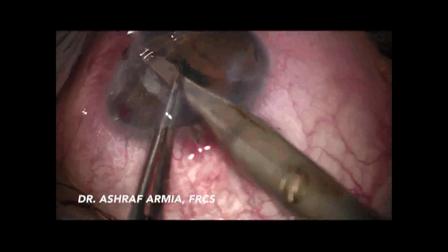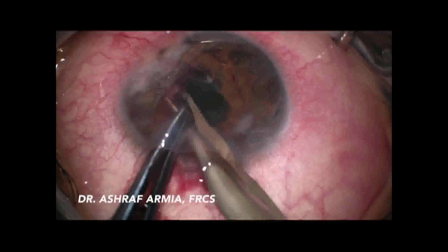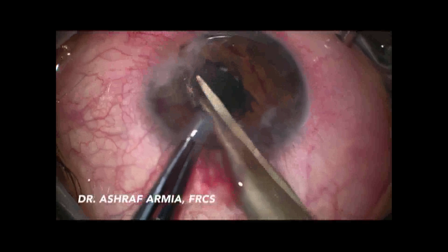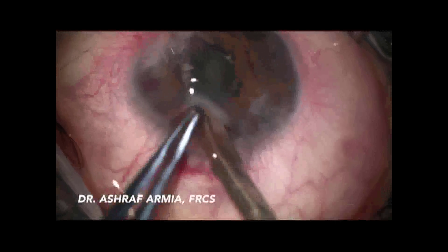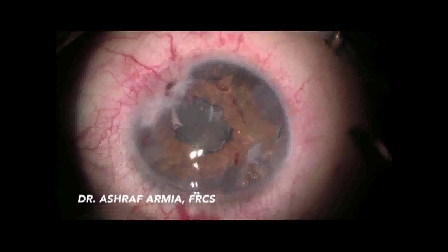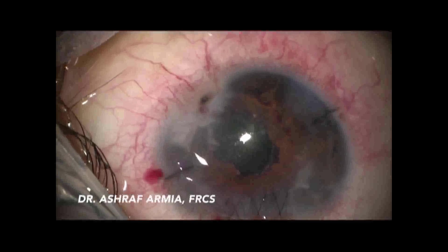My aim was to restore a good-sized clear pupillary area, postponing IOL implantation for several months to allow the eye to become quiet. Finally, I succeeded in closing the wound with a continuous 10-0 nylon suture, leaving the eye formed with a clear pupillary area.